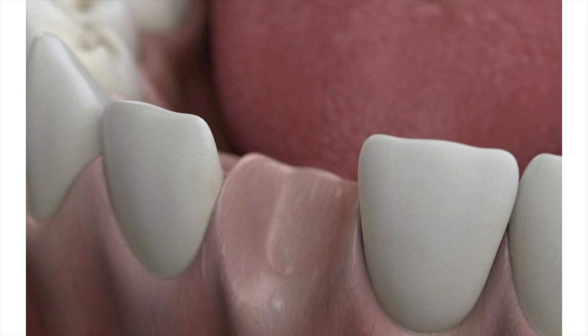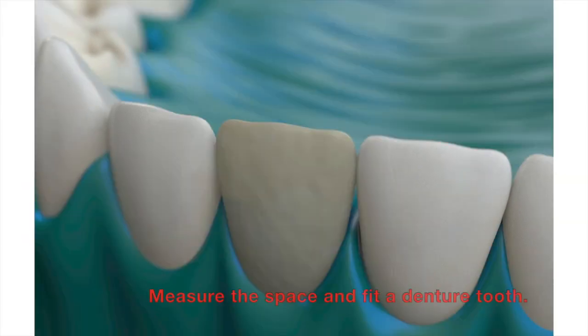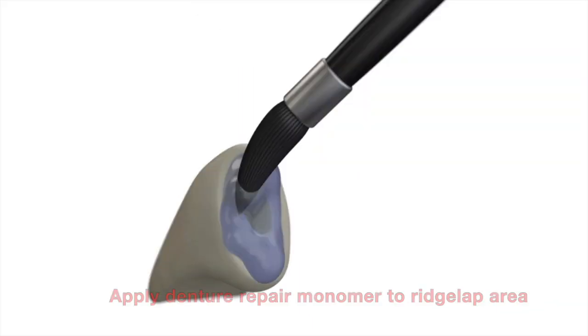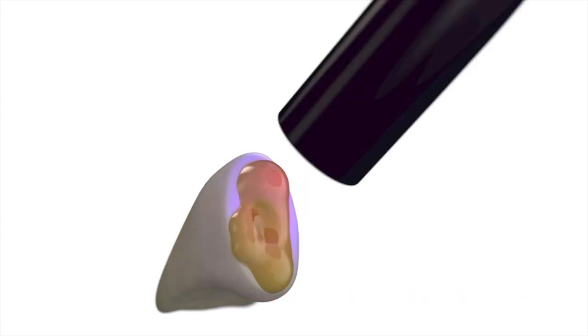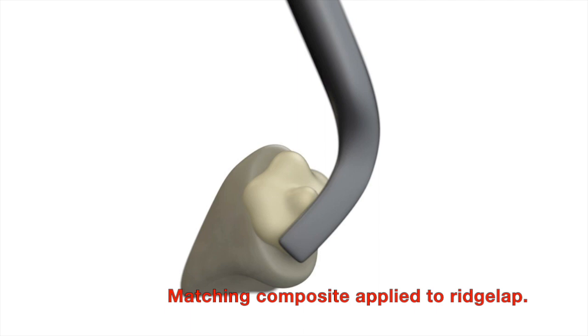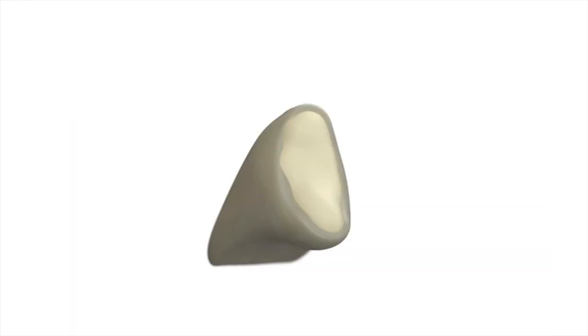Let me show you how to place a resin-bonded bridge through the following illustrations. You will encounter two clinical scenarios: one is a fresh extraction site and one is a healed ridge lap area. The first step is to measure the site and establish a denture tooth that will fit. Step two is to create a retentive prep into the underside of the ridge lap area of the denture tooth. After the prep is performed, apply a small layer of monomer from your denture repair kit, followed with regular bonding liquid and light cured for 10 to 20 seconds. Once cured, apply a small amount of regular composite to the underside of the denture tooth, place the uncured material back into the mouth, seat it onto the ridge lap area, and light cure to take on the shape of the ridge lap itself.